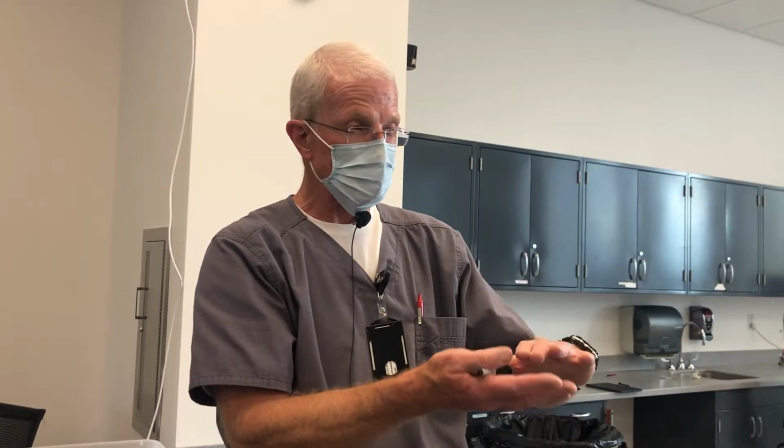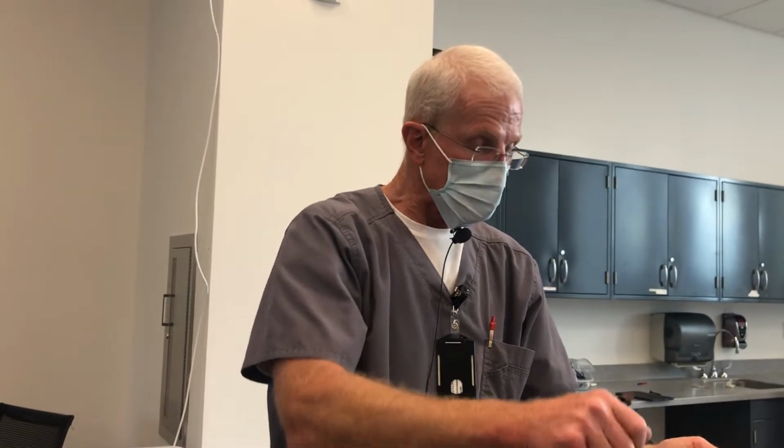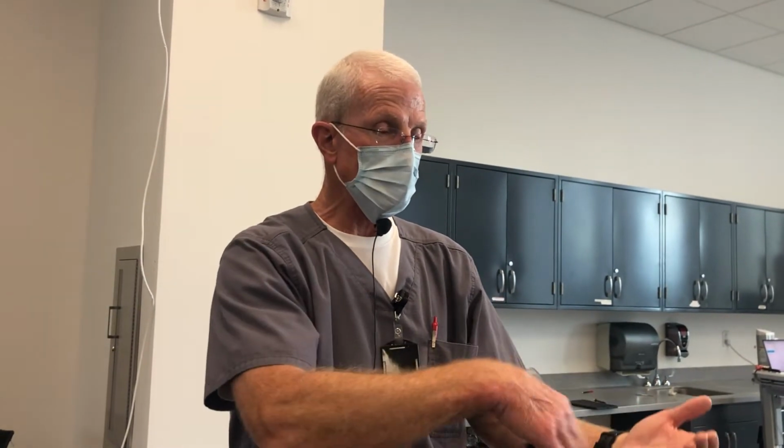Some of the ceramic onlays can be rather thick in places. And so if you add the catalyst and mix, so now it's dual cure, and do your cementation, get it in place. It's going to chemically set on its own within a minute or two or three. Clean up the excess, hit it with the light. You'll further polymerize it, but if there was any of that material that the light couldn't penetrate to, because you mixed the catalyst in, that will cure all the way, okay? That's the difference between cementing veneers and cementing onlays with the aesthetic resin cement: you want to add the catalyst if it's in the back of the mouth.